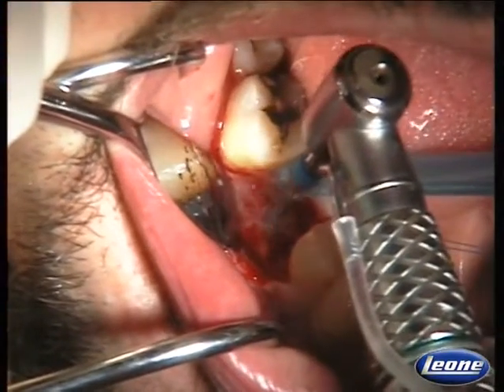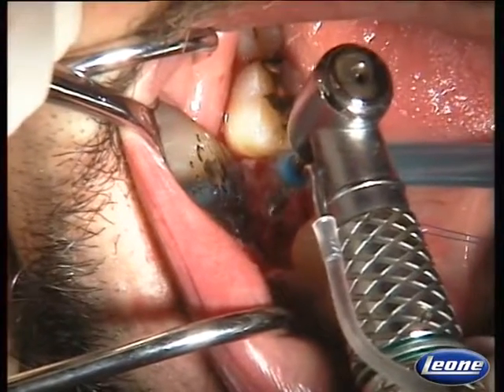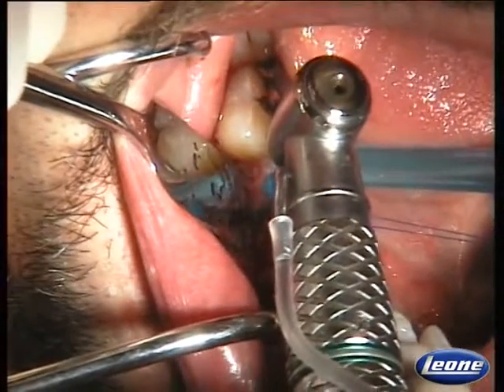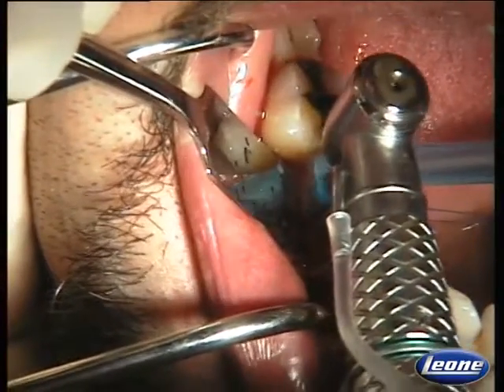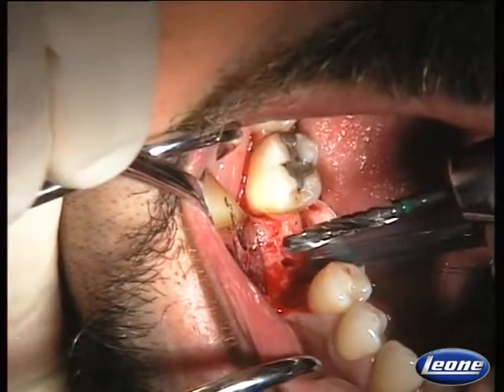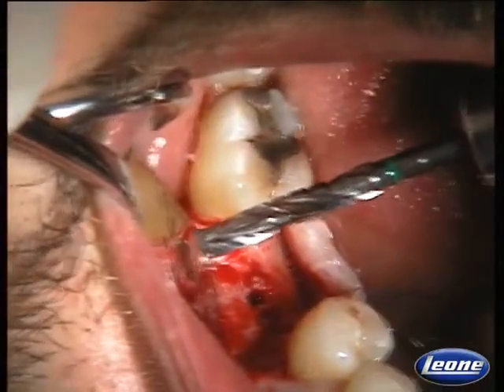6.5, 8, 10, 12, and 14. This is the twist drill for a 3.3 implant. The 14 millimeter depth mark is the last depth mark on the cutting portion.